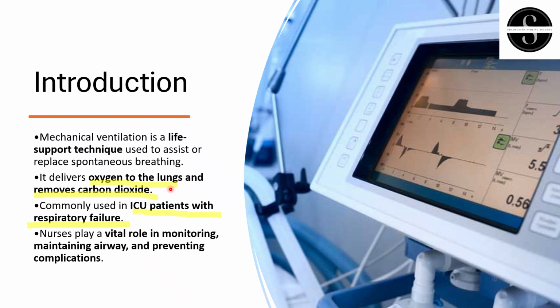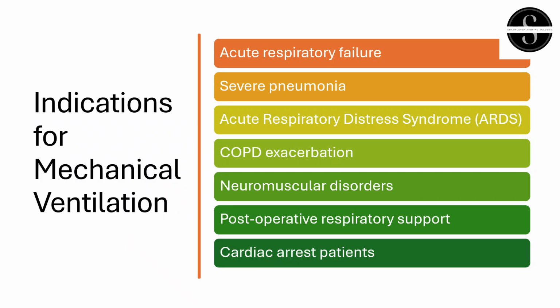The lungs take in oxygen and remove carbon dioxide, and the mechanical ventilator acts the same way. We use it commonly in ICU patients with respiratory failure. Nurses play a pivotal role and should be well versed in handling the ventilator in order to bring out a successful clinical outcome. Clear?